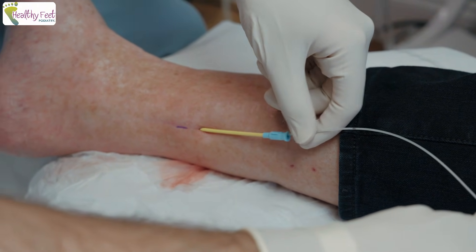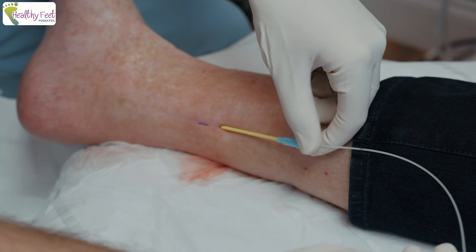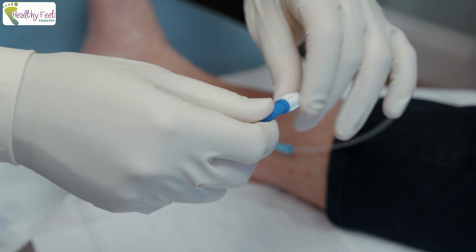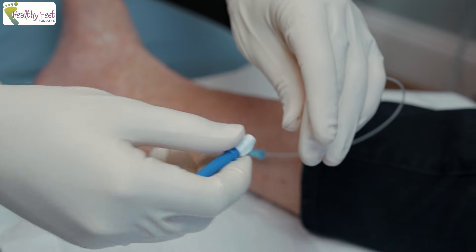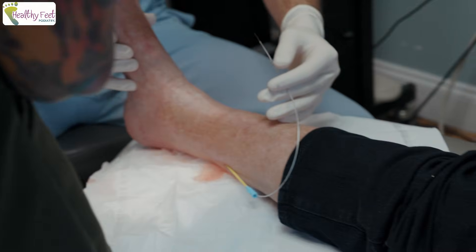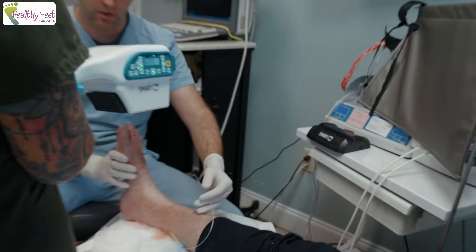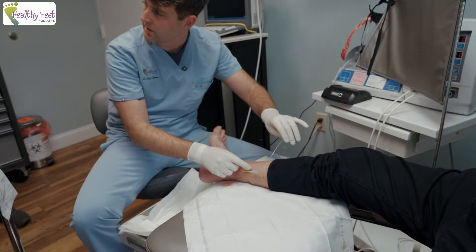Now we're just putting in the lead — we'll go down to a little bit of resistance. I'm going to straighten your leg out again for me. I'll rotate a little bit and take this out.